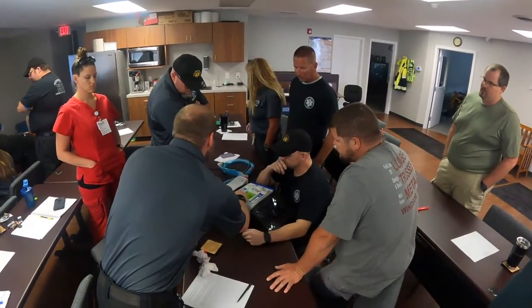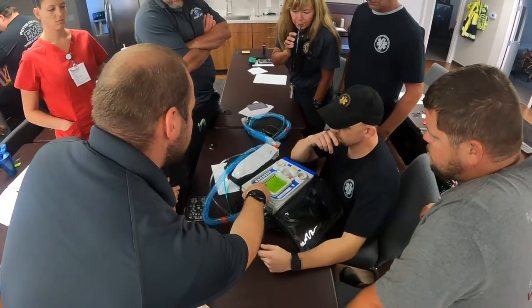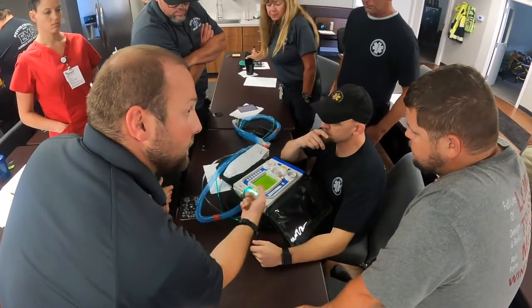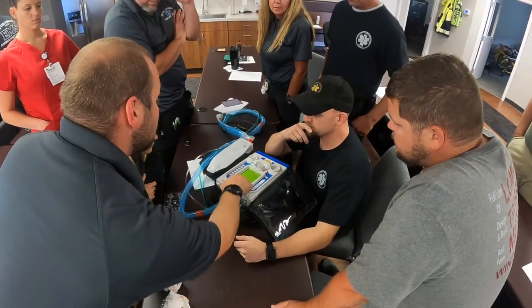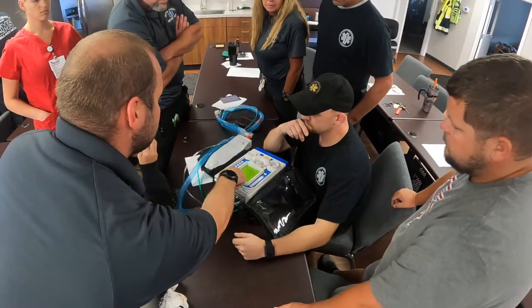We're not going to worry about heart rate standby or SpO2 because again, we use our monitor. FiO2, we can set an alarm for that if we want to. There's really no need because we're constantly monitoring it anyways. We already have our high alarm set for 30 and our low set for 10.